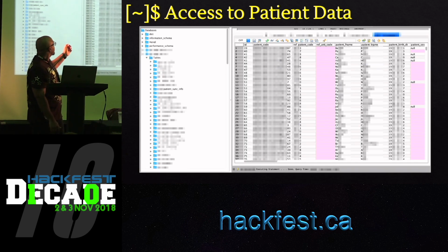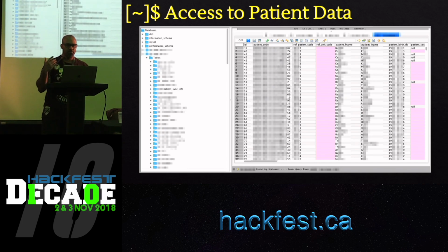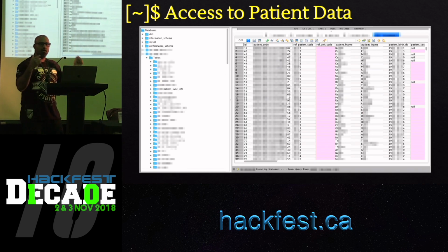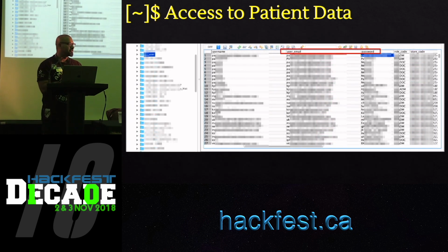If you look at some of the database content, there's patient code, there's another patient code for some reason, then there's patient first name, last name, date of birth, gender of the patient, and so on. Tons of interesting tables. I couldn't include screenshots for all these tables, but here you can see that there's a column for username, password. Obviously, password was in plain text. And then there is something called a code. The code tells you if that particular user is a patient, a manufacturer, an administrator, a doctor, or a pharmacist. So you can take these logins and log onto the portal as different users and gain access to even more medical records.